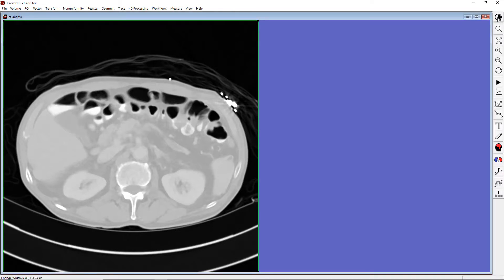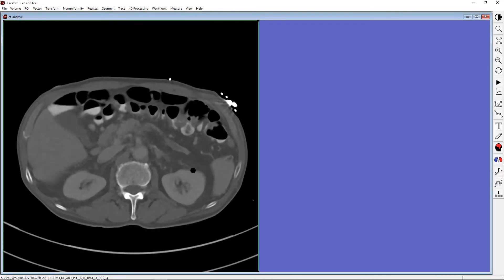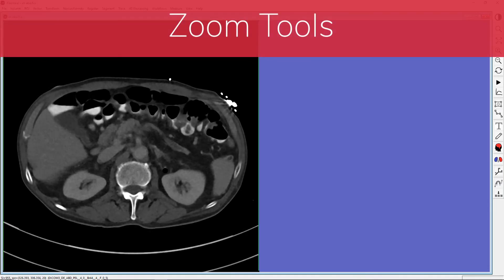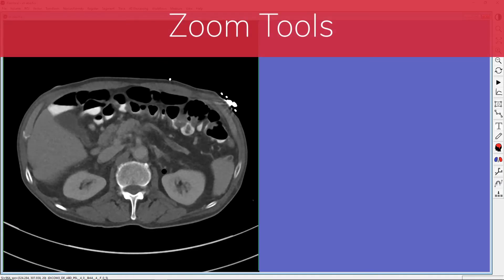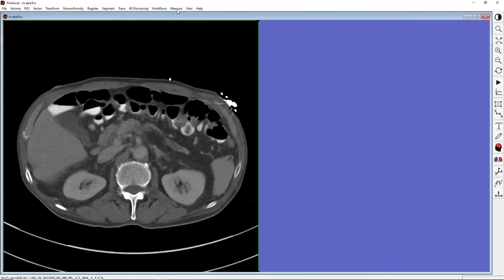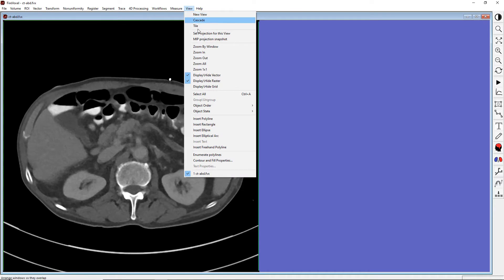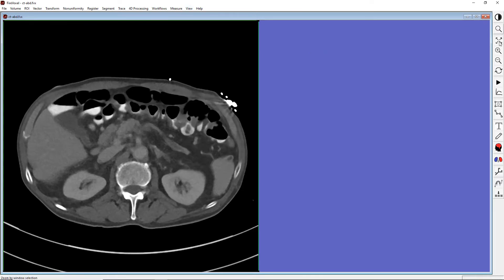Now, let's readjust the window and explore FireVoxel's Zoom tools. They are available either through the View menu or through the main toolbar. The first option is Zoom by Window. It allows us to select and magnify a rectangular portion of the image.